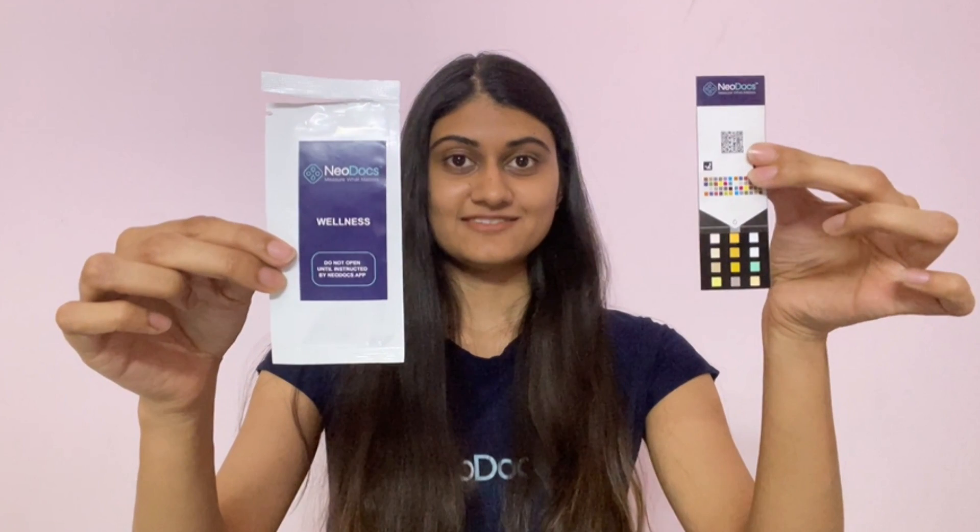Tear the test card pouch and take out your test card. Take out the test card only when you start the test so that it doesn't get contaminated from the moisture.